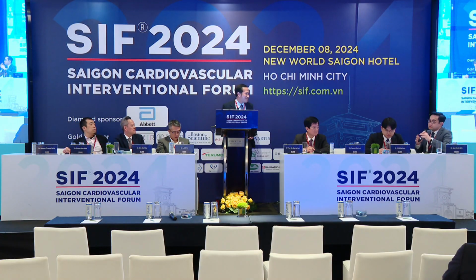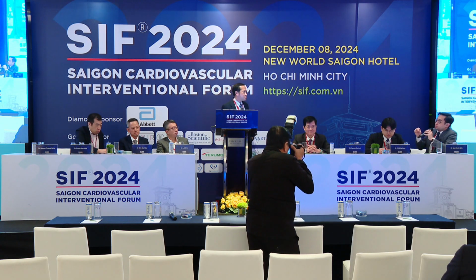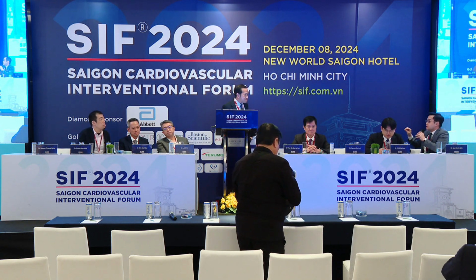And I have some comments on this, because we try to use this technique to preserve the ostium of the side branch. So I think any balloon dilatation before wiring should be avoided, because if you just do a balloon dilatation or kissing balloon, sometimes ostial dissections may happen. So if you want to use this jail balloon concept, the balloon should be smaller than the actual vessel size. If you use one to one and you do some balloon dilatation, then there may be dissection. Yes. Thank you. Thank you.